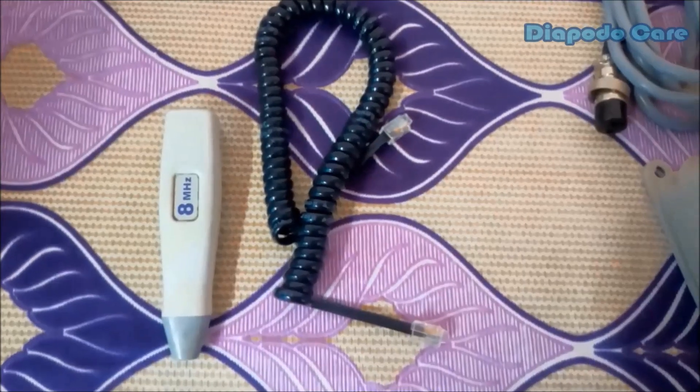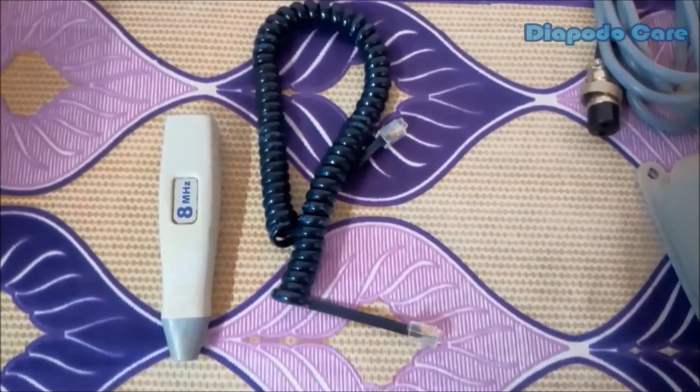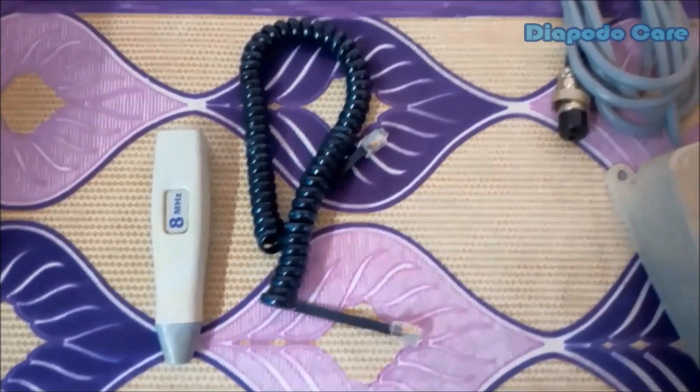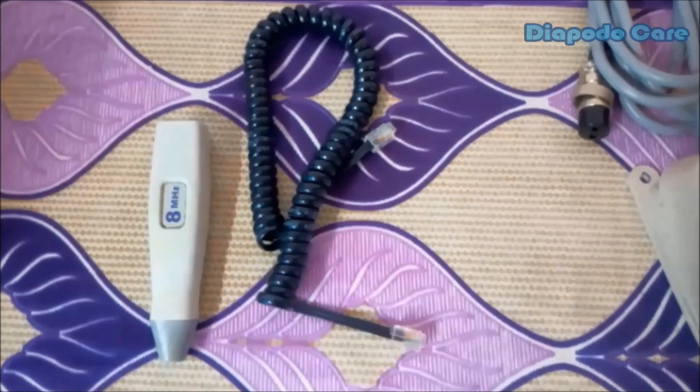The next accessory is the 8 MHz ultrasound transducer probe for tracing arteries. This probe connects with the main unit using the provided spring cable. This 8 MHz probe is a unidirectional transducer with highly enhanced quality.